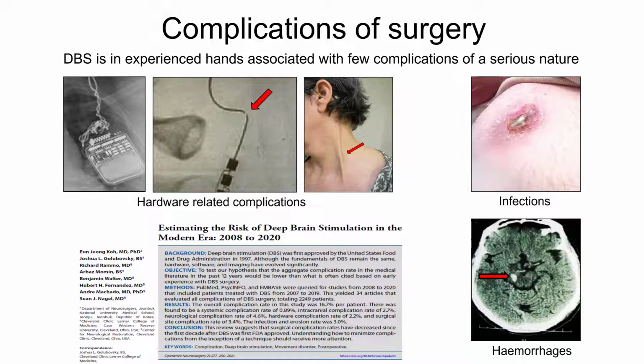Most often, the patient will notice tenderness, redness, heat and swelling somewhere over the implant, and this might progress until the implant is exposed. In order to deal with this, it is most often necessary to remove some or all of the implants and to treat the patient with antibiotics for some time before the implants can be replaced. This is seldom a major threat to the life and health of the patient. In the literature, the reported number of infections and erosions is rather high, around 3% each.